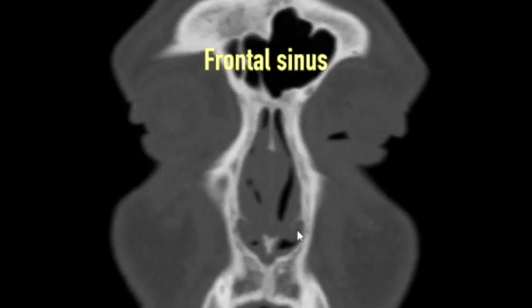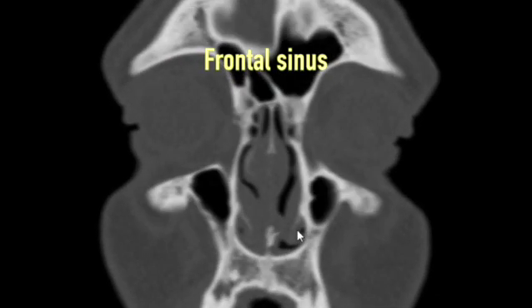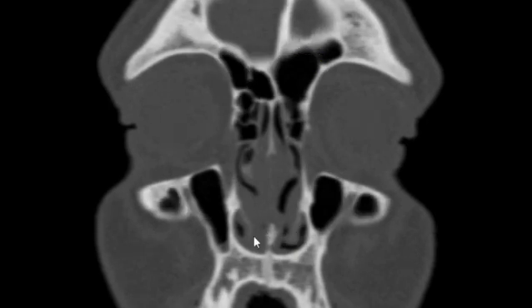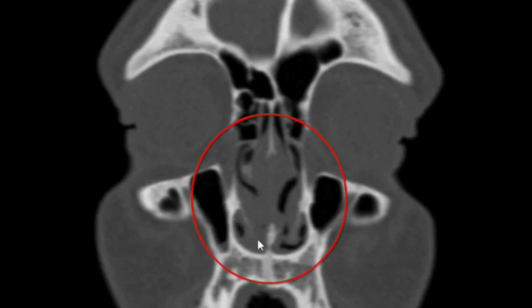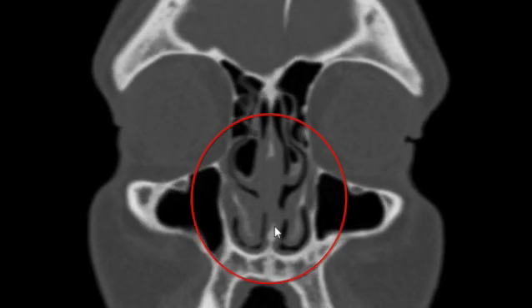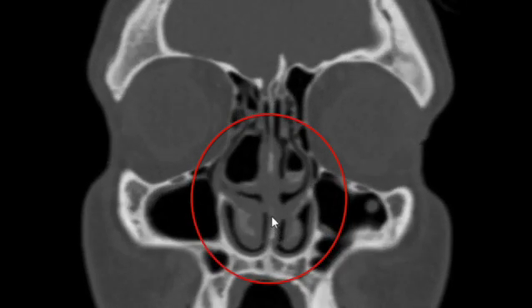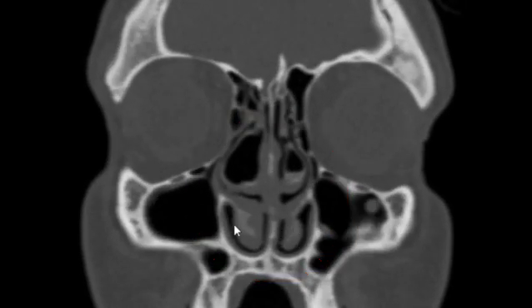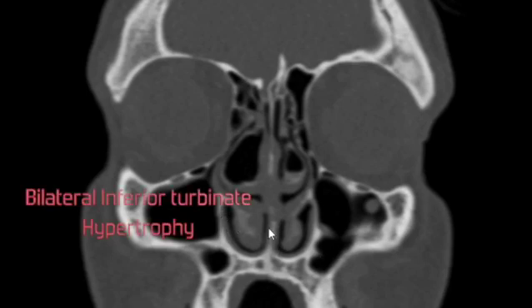As we proceed from anterior to posterior, immediately what we see is that there is overcrowding at the anterior nasal cavity. The inferior turbinate is quite medialized, and not just that — they are swollen, they are hypertrophied, they are enlarged. So there is bilateral inferior turbinate enlargement.